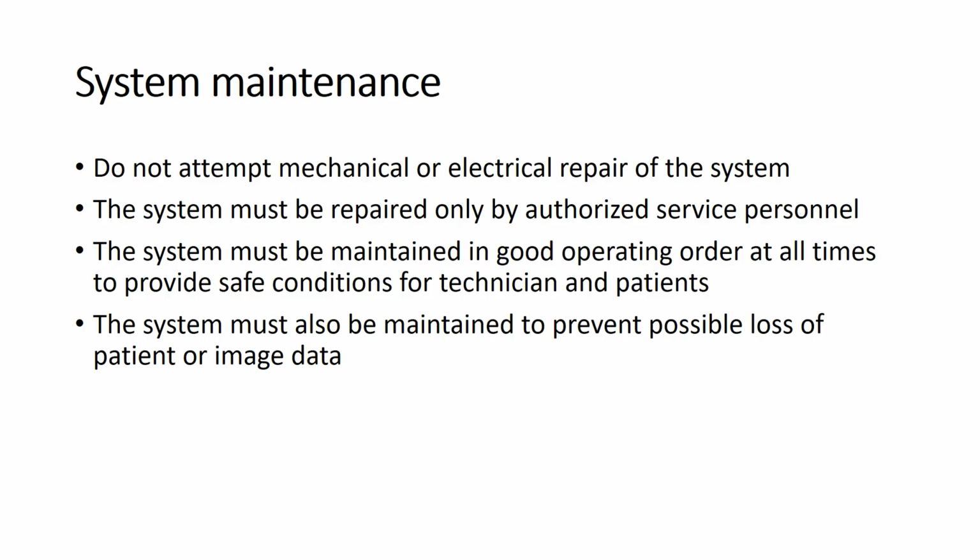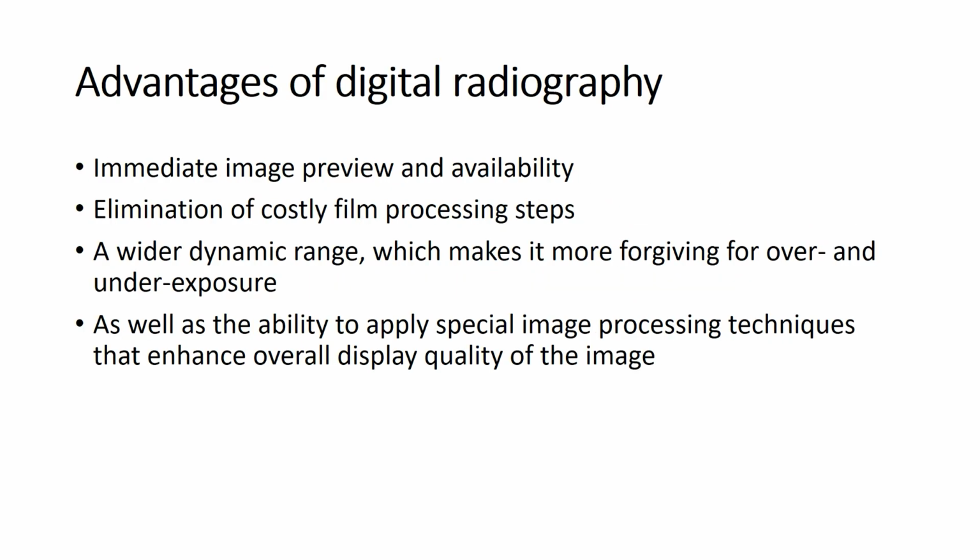The system must be maintained in good operating order at all times to provide safe conditions for the technician and the patients. The system must also be maintained to prevent possible loss of patient or image data.